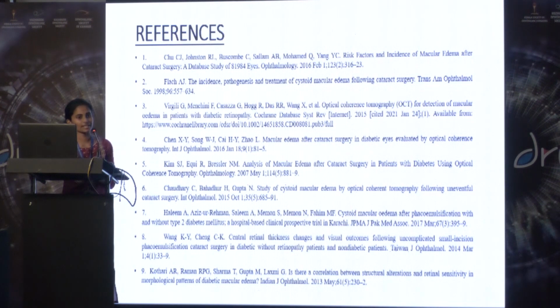Sorry, sir. The CFT range was 220 to 294. Anything more than 294 was considered as macular edema, and the cystoid spaces by analyzing the OCT pattern. Did you exclude those with cystoid spaces or they were included? Actually, they were included, but intravitreal injections were not given within 3 months of surgery.